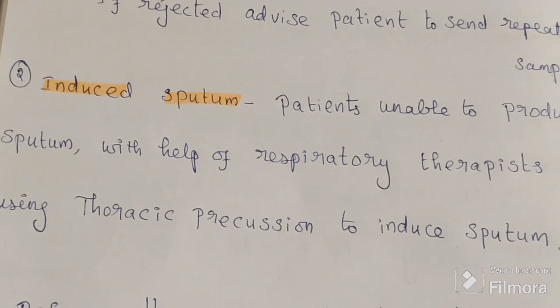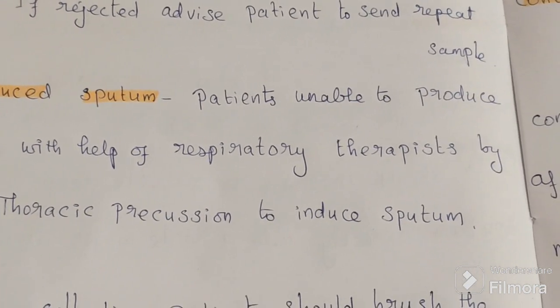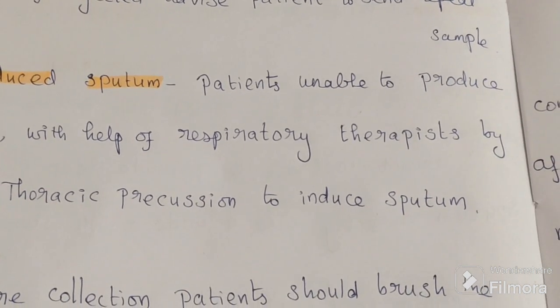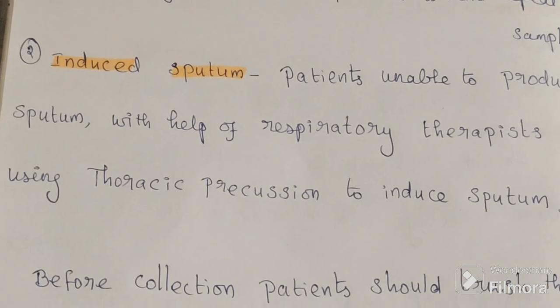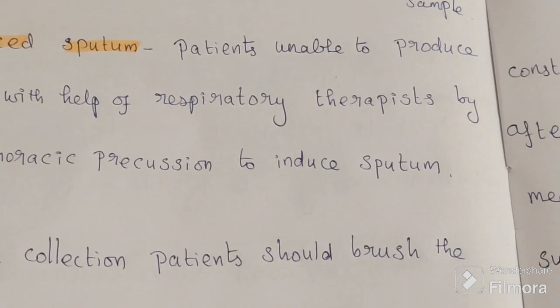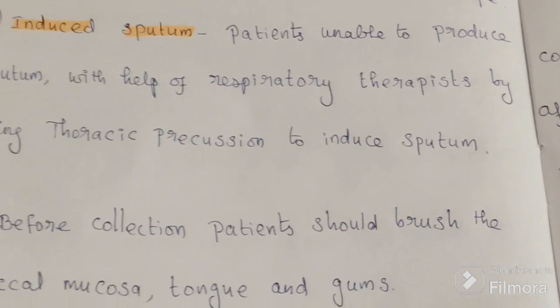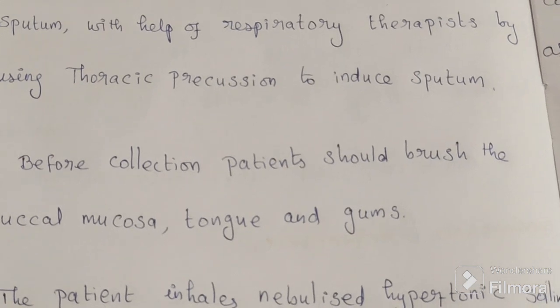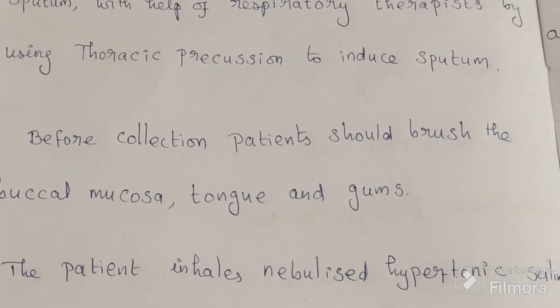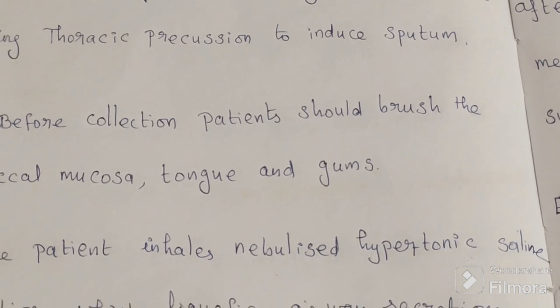Then the second method, induced sputum. For a patient unable to produce sputum, a respiratory therapist helps induce sputum. Before collecting, the patient should brush the buccal mucosa, tongue and gums.